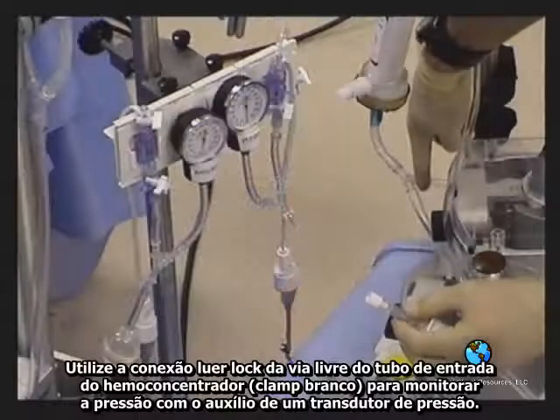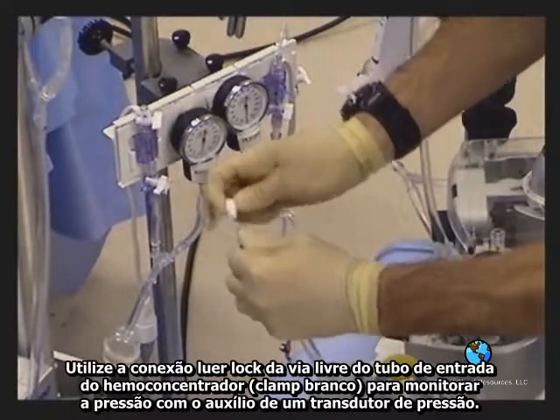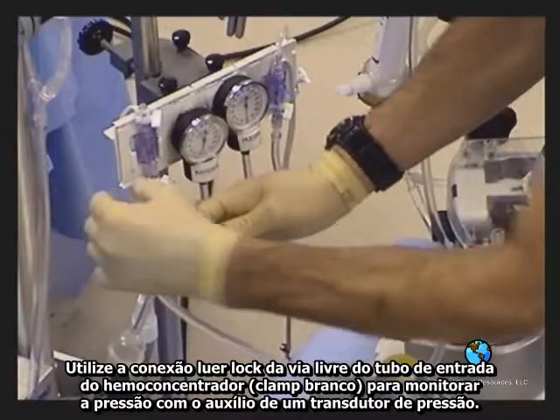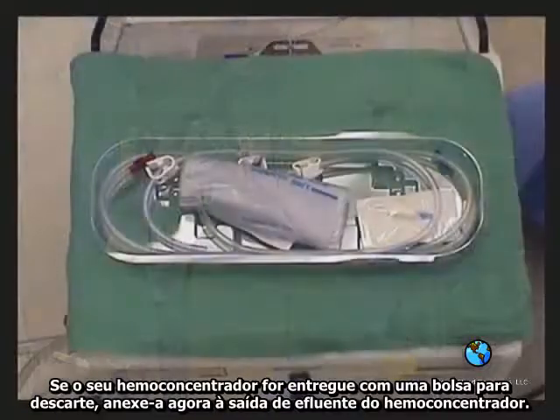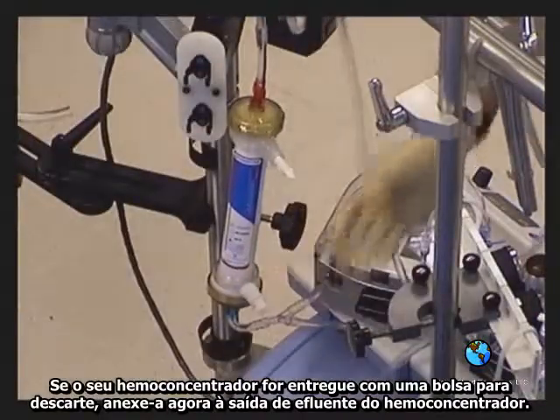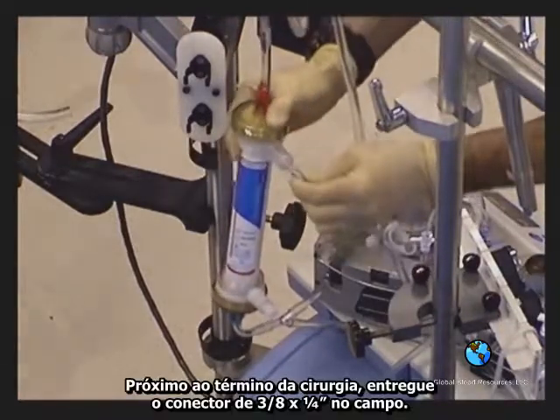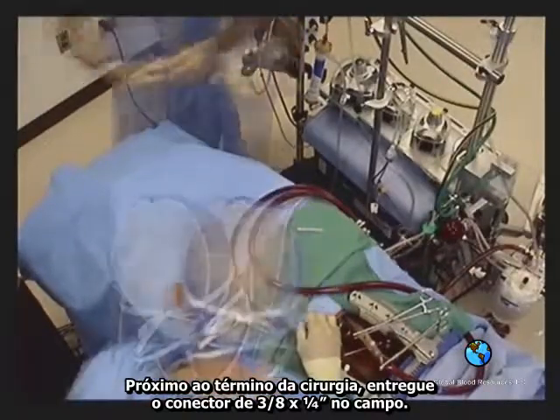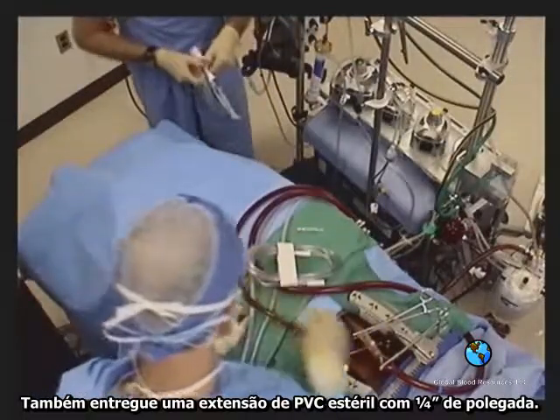At the tubing set Y near the outlet of the roller pump, use the white pinch clamped standard limb to connect to the transducer for pressure monitoring, and turn the stopcock. If your hemoconcentrator comes with a disposable bag, attach it now to the effluent outlet of the hemoconcentrator. No suction is needed. Near the end of surgery, sterilely hand up a 1/4 3/8 connector to the field. Also hand up some sterile 1/4-inch tubing or suction tubing to the field.